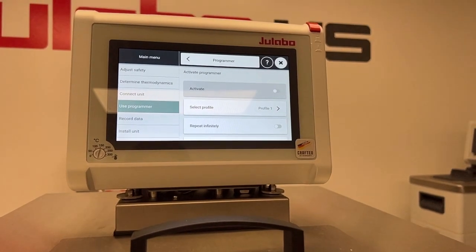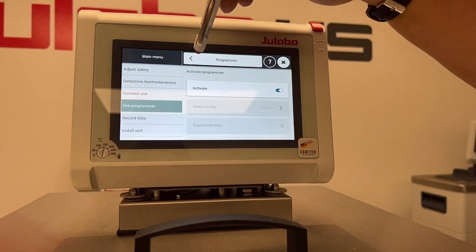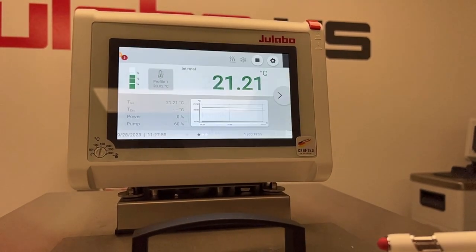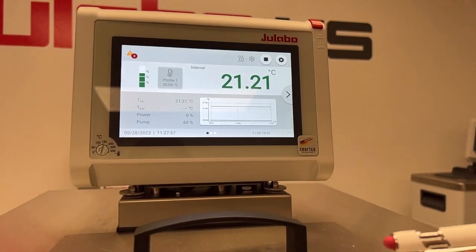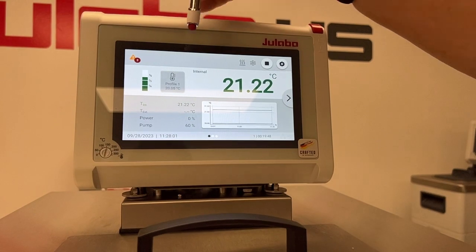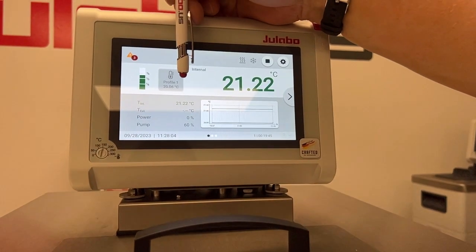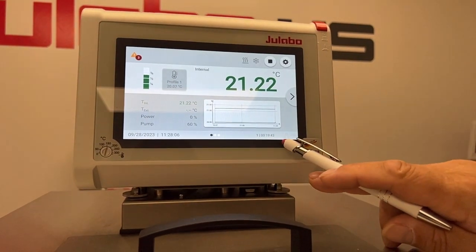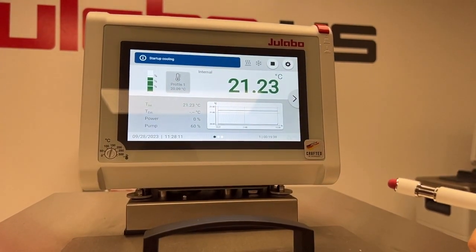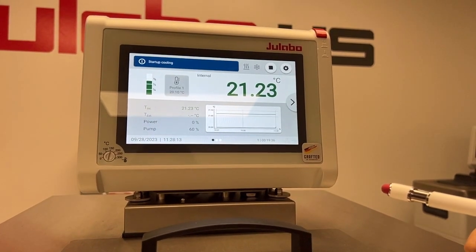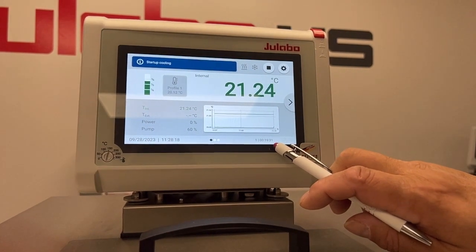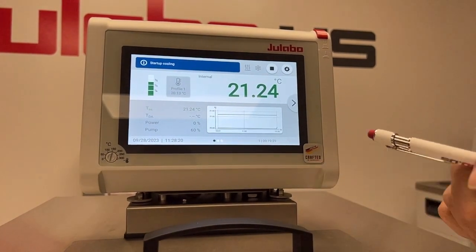To activate, once you click Activate, the unit will start and begin running the profile that you've selected. You'll notice in the temperature setpoint key here it will say Profile 1. Down at the bottom you'll see the graph flashing, which also indicates that it's running the profile, and it shows you the step and how many minutes it's expecting to go.